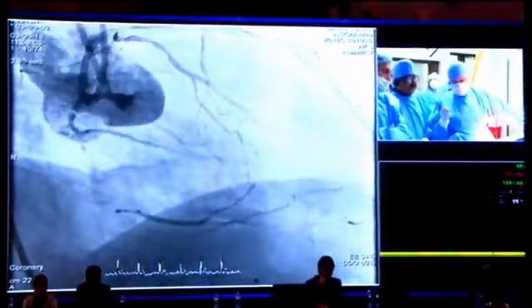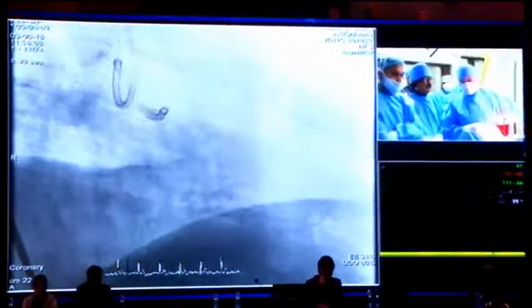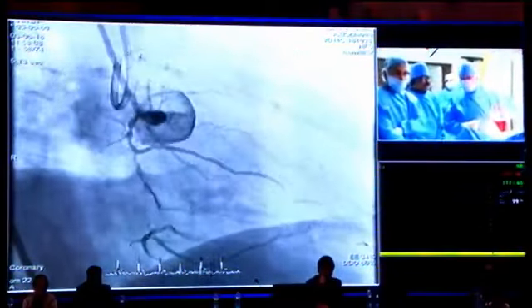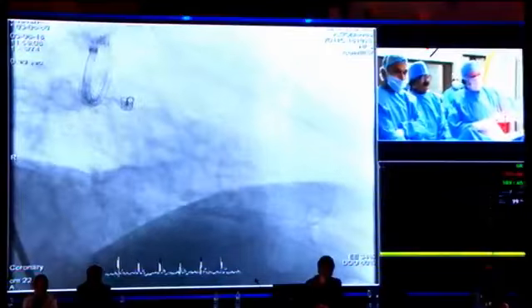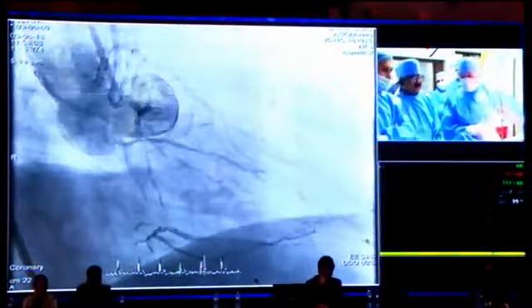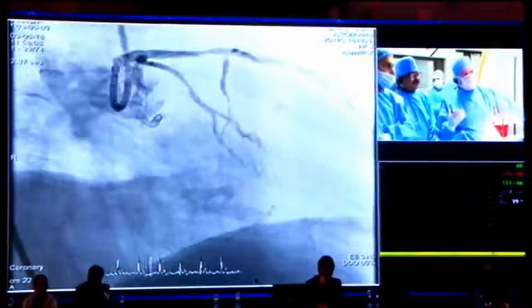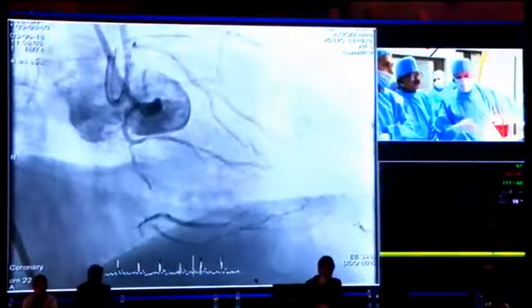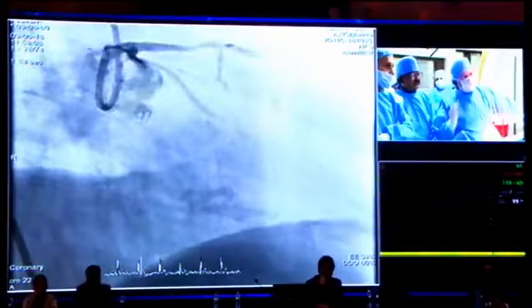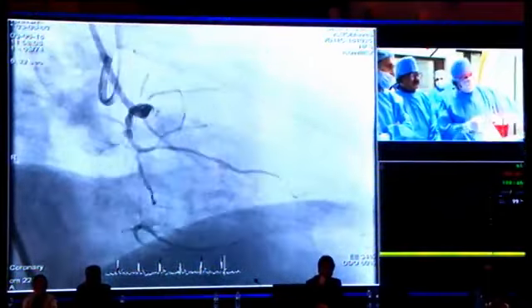So first of all, thank you, Dr. Goel and his team, for having me here to do a live case in this Center of Excellence in CTOs, also with the nice equipment. We hope to show you also some CT images that you will then comment. But basically the setup is a typical situation. A patient comes with ACS of a non-CTO lesion, and the ACS is treated, and then we should treat, I think, the CTO of a large territory.